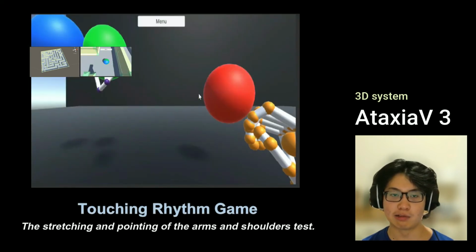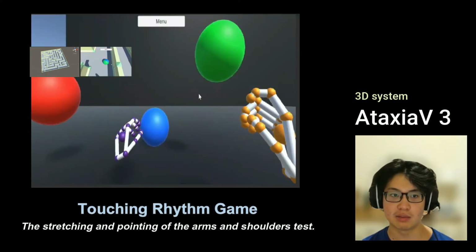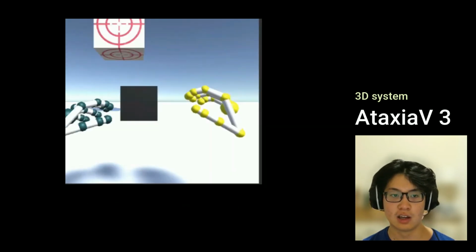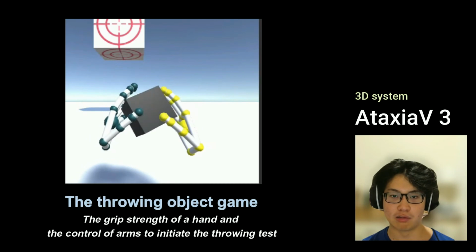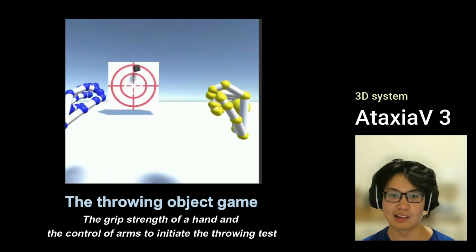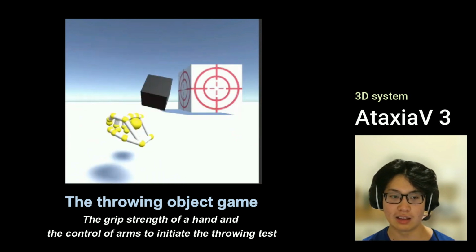The touching rhythm game is where patients touch randomly appearing balls to make them disappear, and through this game you can test the stretching and pointing of the arms and shoulders. The throwing object game is a game in which you grab a box and throw it to hit a target, testing the grip strength of your hand and the control of the patient's arm to initiate the throw.